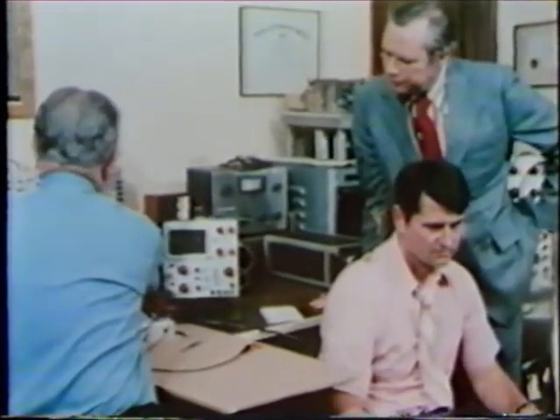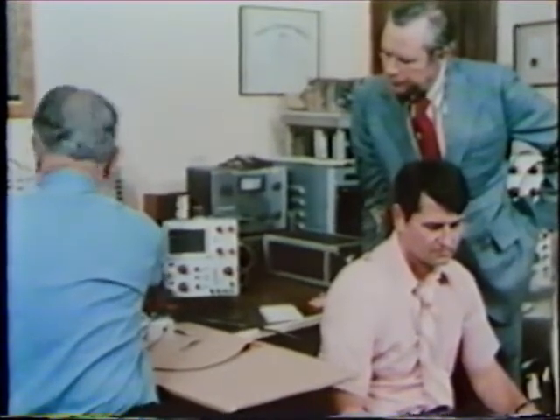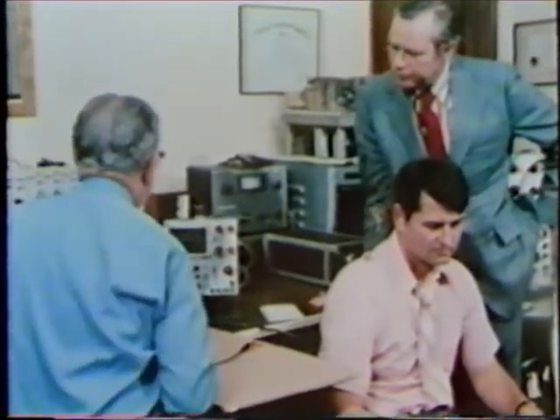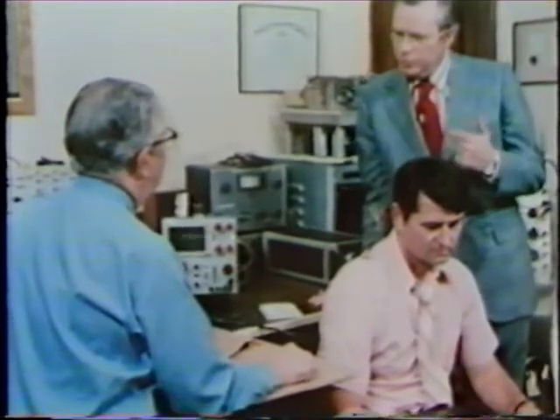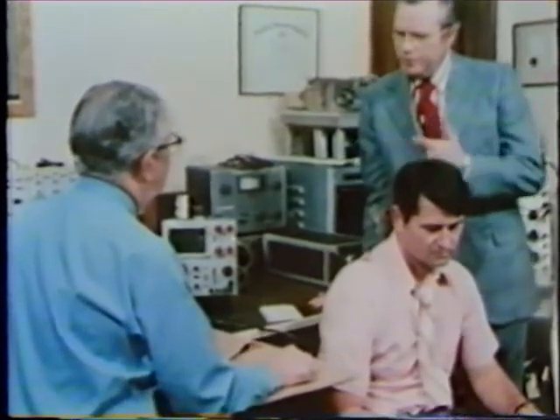During this phase of the investigation, a very curious finding emerged. Previously, electronic testing of patients with normal inner ears during stapes or chronic ear surgery had always indicated stimuli of 1 to 4,000 cycles would be heard best. Grazer had no responses at these speech frequencies. Apparently, the absence of hair cells greatly changed the stimulation characteristics of the inner ear.